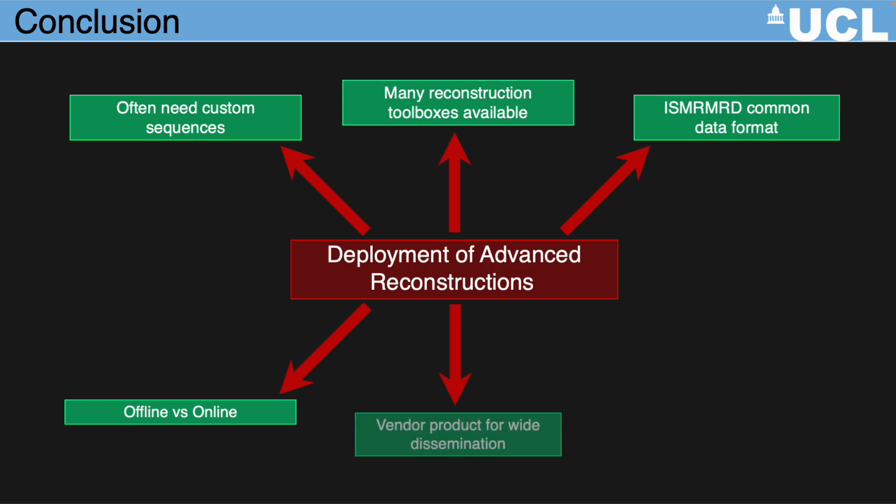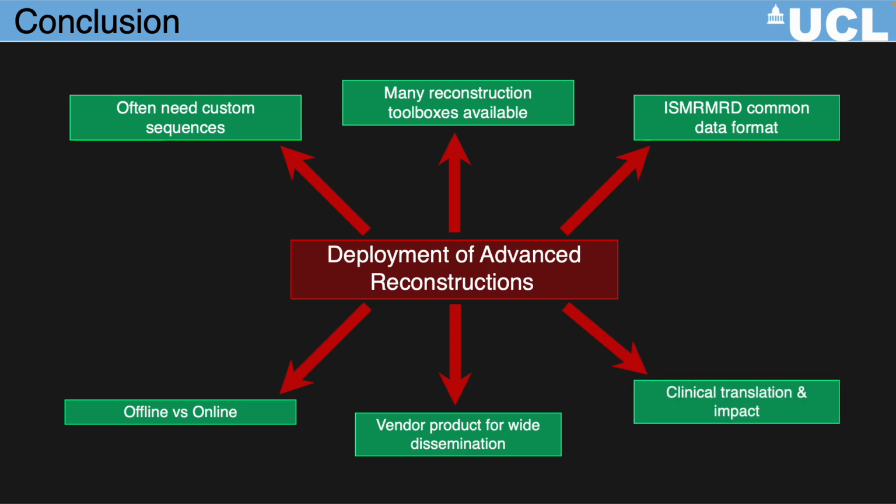I've also showed different ways of using novel algorithms, including offline reconstructions and online reconstructions. However, ultimately, we should be aiming to get more of these advanced reconstruction methodologies through regulatory approval and into vendor product to enable wide-scale distribution, clinical translation and impact in patients.